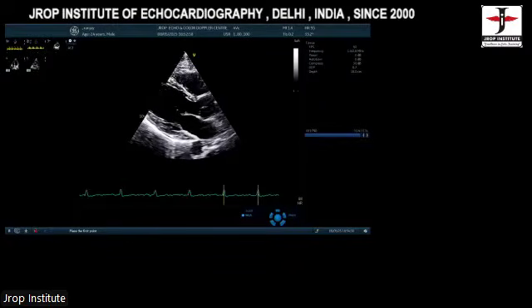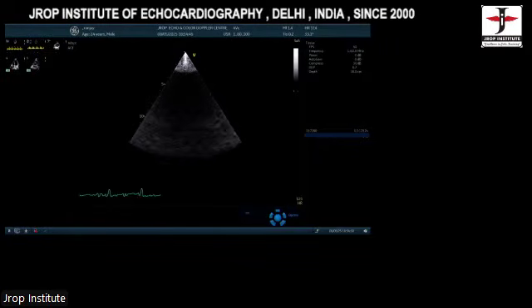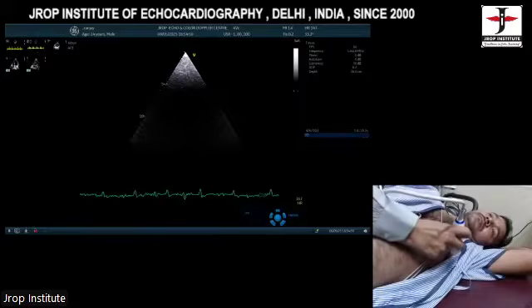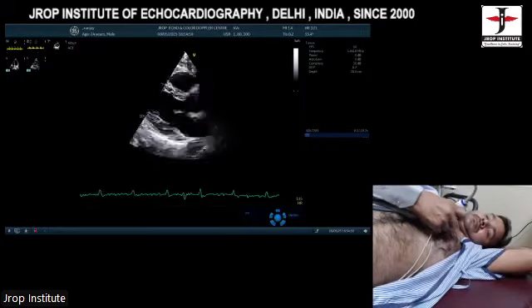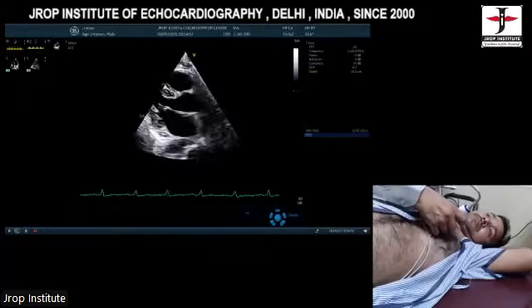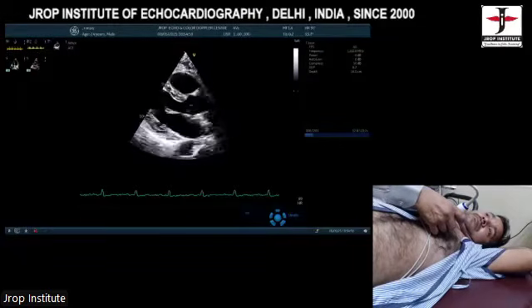Next question. In modern day echocardiography, what is the role of M mode measurements? Like, do we stick to 2D measurements itself, for the ejection fraction or for the LV cavity dimensions? First of all, forget about ejection fraction. Never use ejection fraction as a calculator for LV function. Look, if you are a very good echocardiographer, we make our work easy.